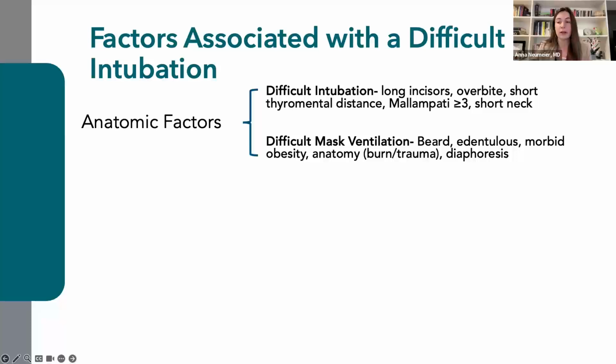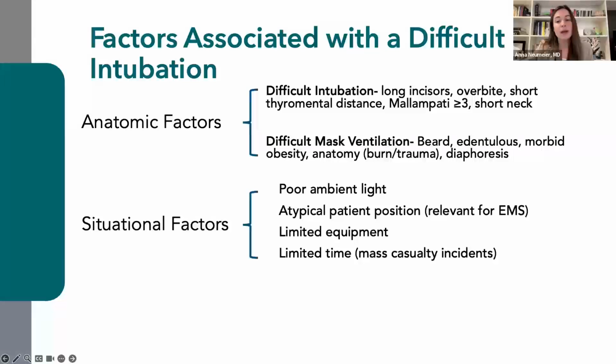could lead to difficulty effectively performing an endotracheal intubation via direct laryngoscopy. Similarly, it is important to identify whether patients have factors associated with a difficult bag valve mask ventilation, as if you anticipate you cannot ventilate the patient, then sedation and neuromuscular blockade is too high risk and an alternative approach to securing the airway is necessary. Situational factors may also influence the procedural challenge and can become of particular relevance in a disaster setting.